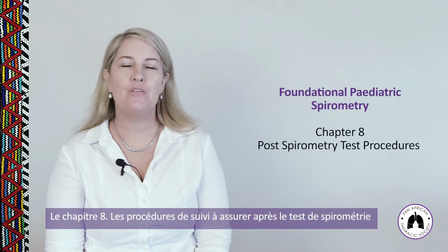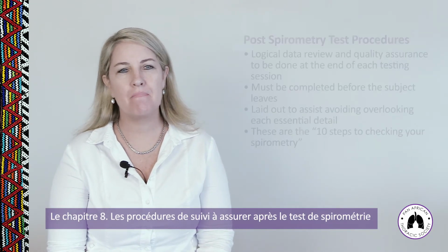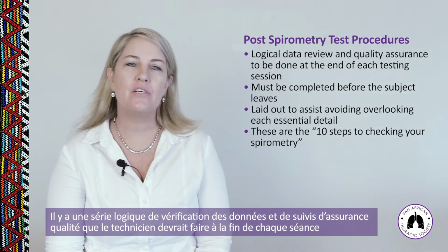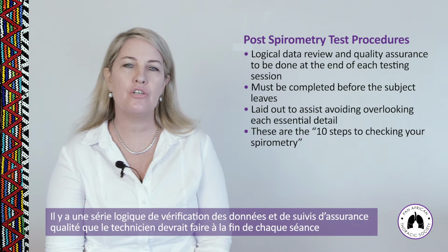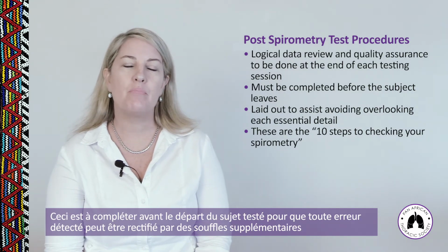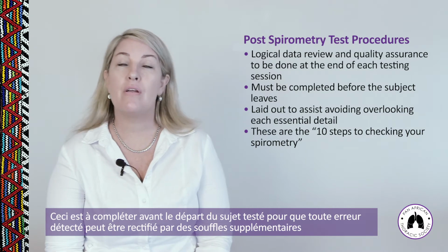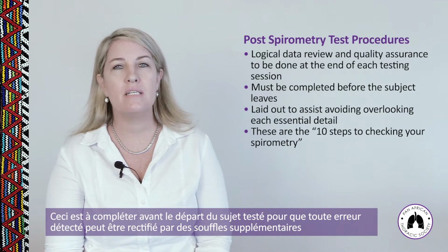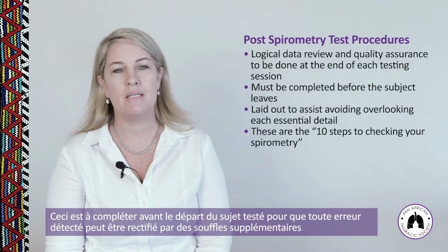Chapter 8, Postspirometry Test Procedures. There are a series of logical data review and quality assurance checks that technicians should do at the end of each testing session. This must be completed before the subject leaves, so that if there are any errors, he or she can blow again until good quality spirometry has been documented.